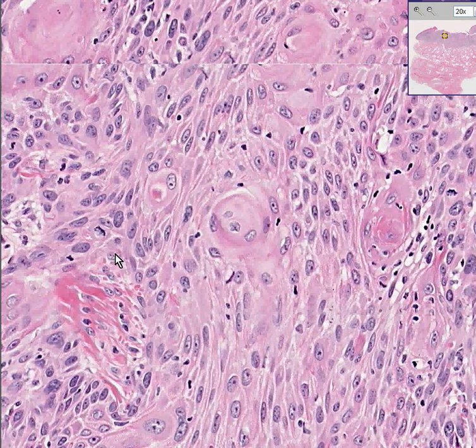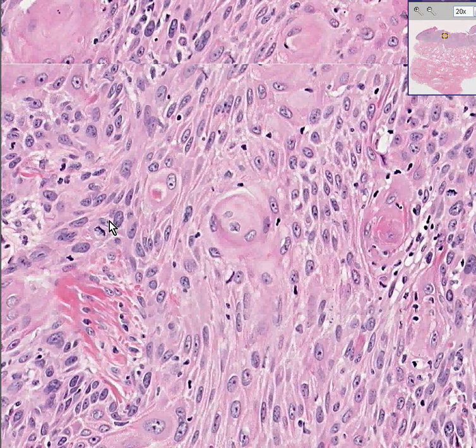But if that was the only thing you saw and not these pearls, you'd call it moderately differentiated. And if the squamous cells were differentiated so poorly that you could hardly recognize them as squamous cells, then you would call it poorly differentiated.